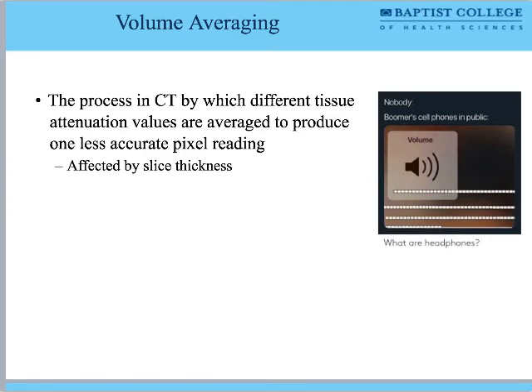What should be the slice thickness through that volume? If it's kidney stones, I want a little tiny slice thickness, little tiny slices so I can see this little tiny thing. If it's cancer, I want the slices to be a little bit thicker, but I want contrast to be there so I can see the difference between the tumor and the normal tissue, because the tumor loves blood, so it's going to drink up that IV contrast. If it's pancreatitis, I need some images without, some images with, some in an arterial phase. I need a bunch of different contrast phases.